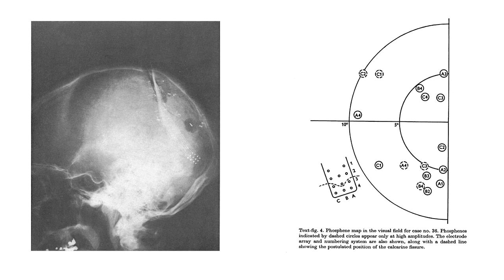Dr. Dobell hypothesized that the placement of the phosphene in the visual field would correlate in some way to the placement of the electrodes, and it was found that the placement of the phosphene in the visual field did correspond roughly to a classical map of the visual cortex. However, there were some conjugate phosphenes, which I'll talk about later, that did not match this map. As you can see in the left part of the figure, the electrodes are implanted within and the wires extend to the skull.